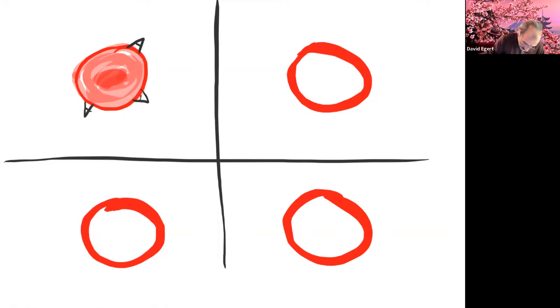Oh, it looks like an A. Like when I say somebody is type A blood, I am saying that their red blood cells have this membrane protein that is this specific shape, specific kind of antigen that we're calling type A marker.